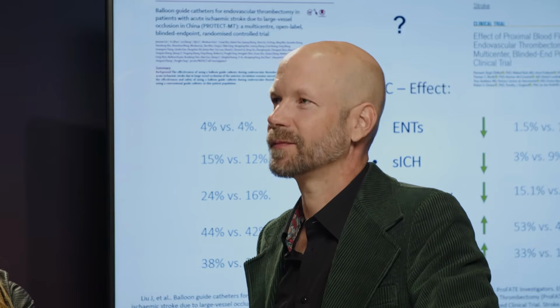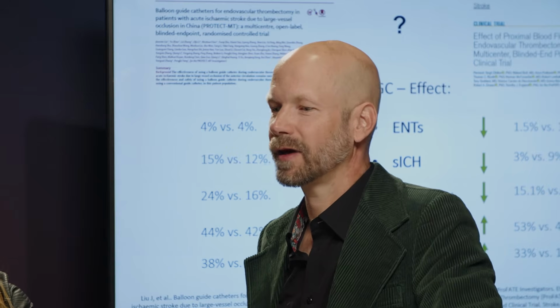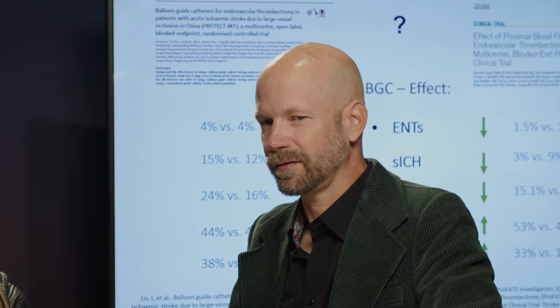So placing the tip very distal might have been of influence on the outcome, especially in the Chinese study, where they didn't place it very distal. And that maybe is because they used the older generations, which are stiffer and not so easily guided up to the distal position. Exactly. I think this is one of the major points where the newer generation of guiding catheters really changes a lot. And as I said, this is the level of evidence that we have now.